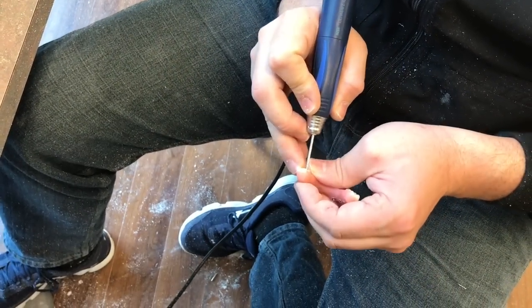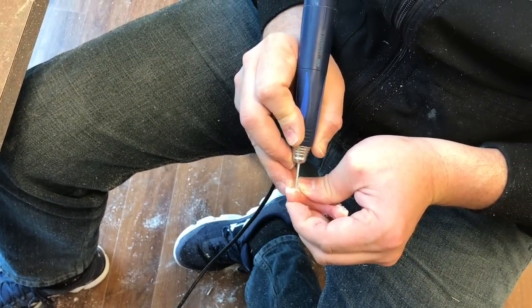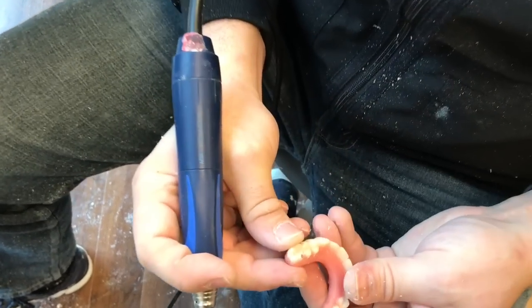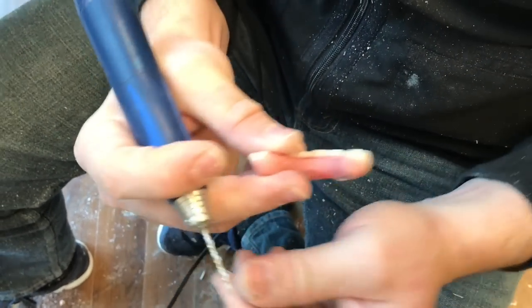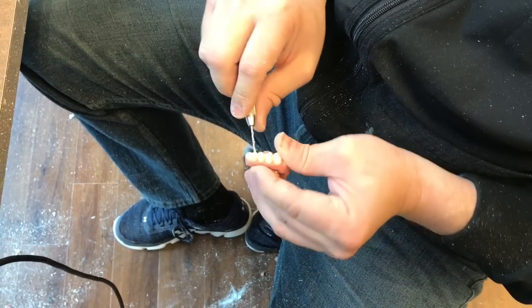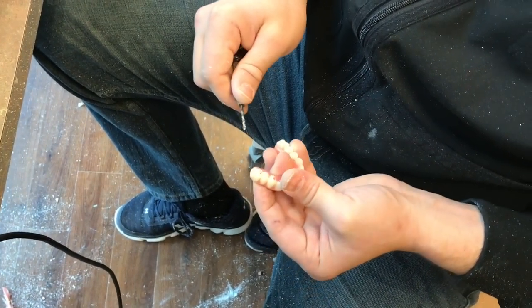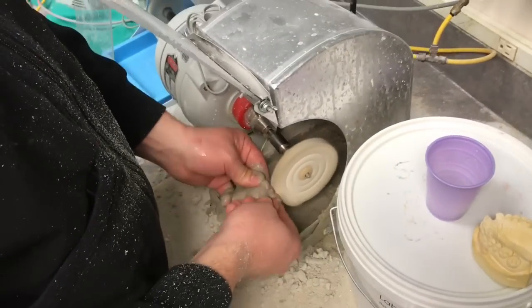So now that we've got a pilot hole, we're going to go down with the guided expander drill, and that expands the screw axis hole to the diameter of the prosthetic screw. Then we use the clearance drill on the pin vice to remove the residual peak cap of the separable fastener.